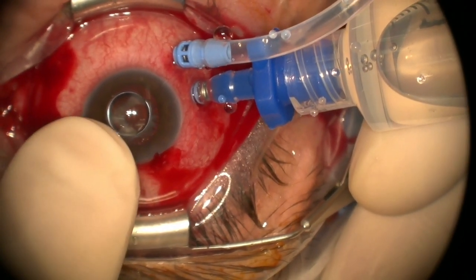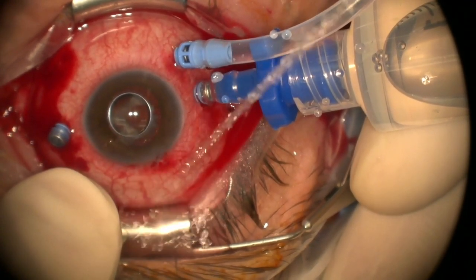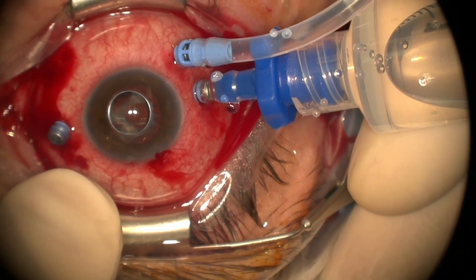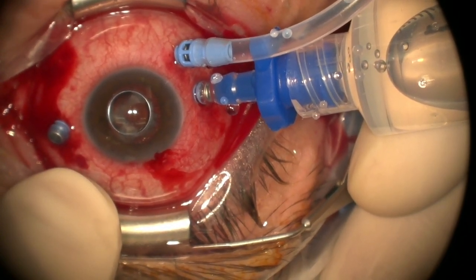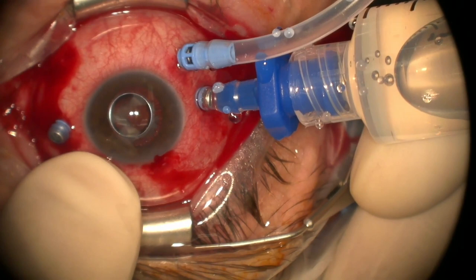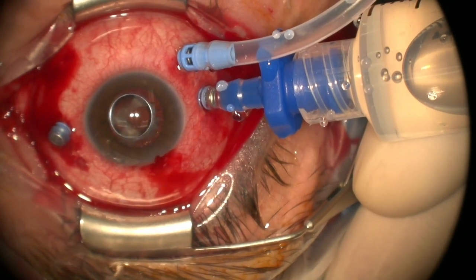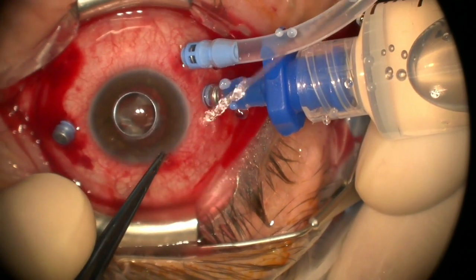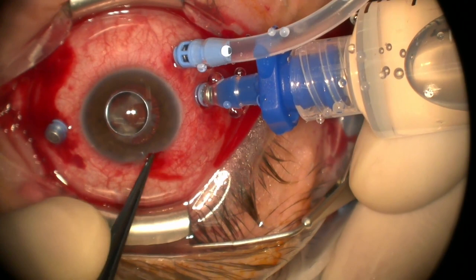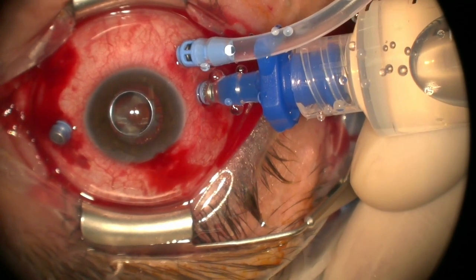I don't want to take out this bubble to the end because once I start pulling that out, I may just pull more oil to the front. Don't really need that either. There we go. Success getting out our suture. It was quite the struggle. Hopefully that'll be the hardest part of our case.